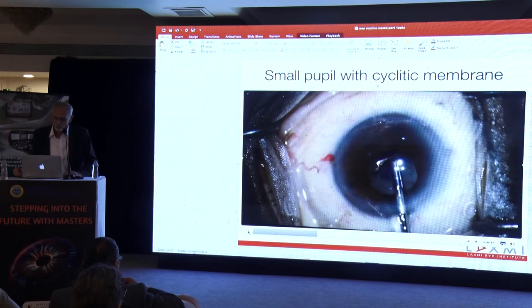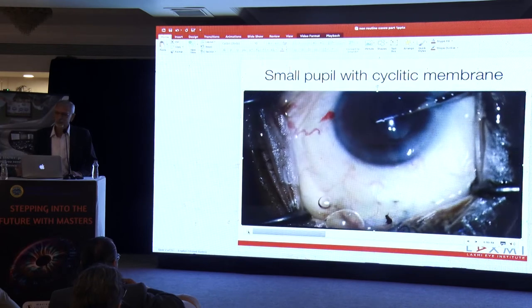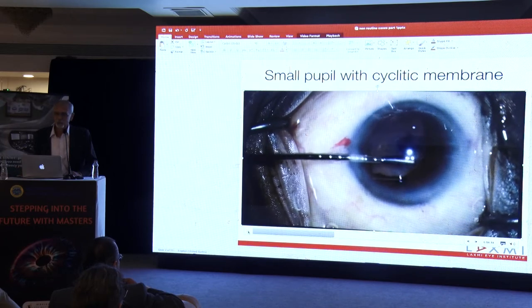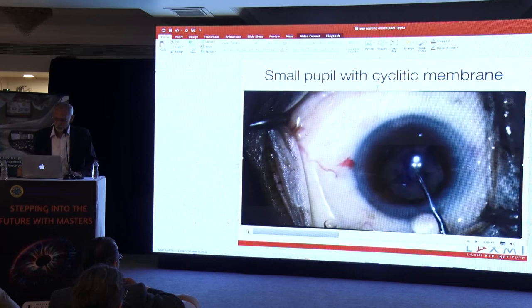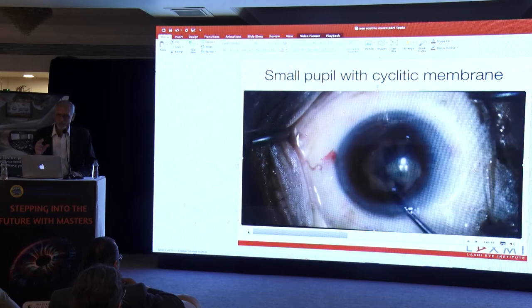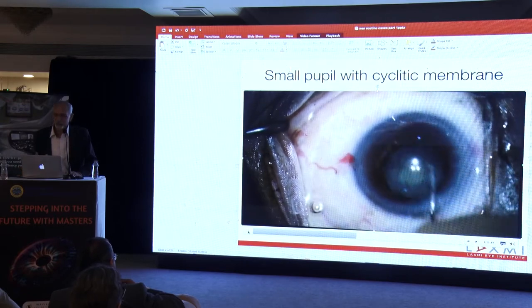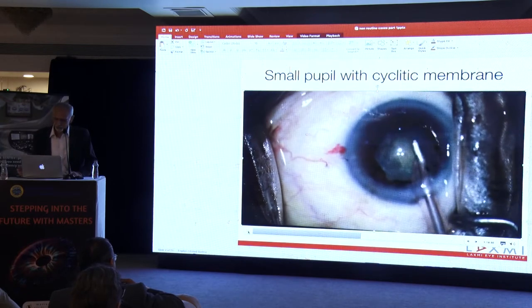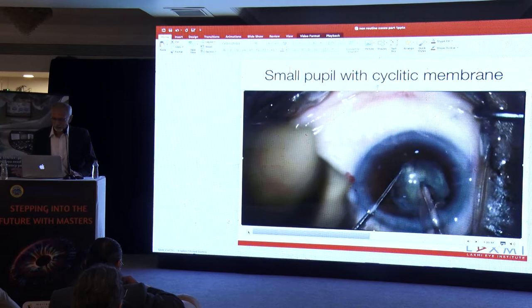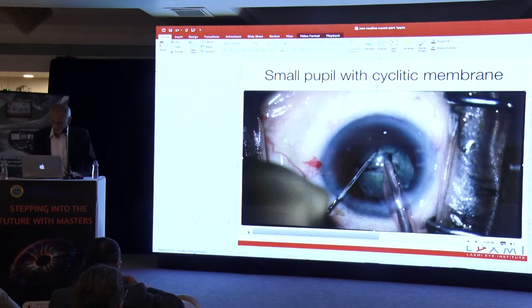One of the expanders that works well in such cases is VHEX. VHEX is really good for such soft ones. If you have a rigid pupil, this is probably not the pupil expander you would go in for. And when you have a small pupil, to improve your visibility, you would always use some stain. The surgery here normally is not a big issue. You can choose a technique of your choice. I normally prefer the burst mode. There's nothing much to show in this.